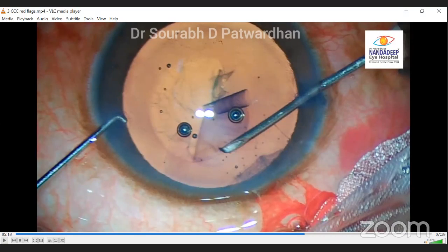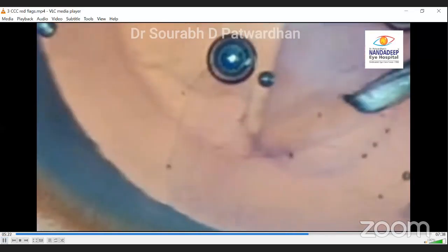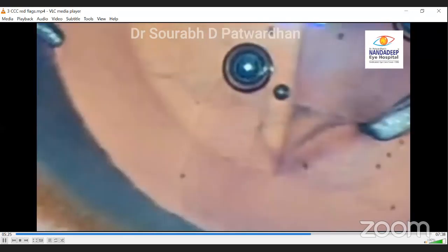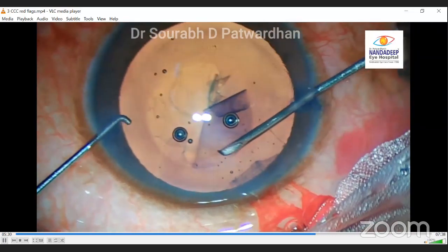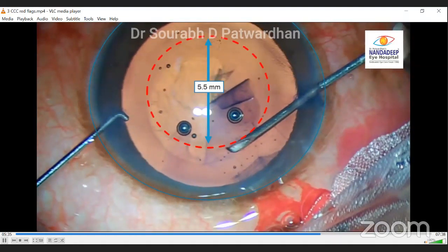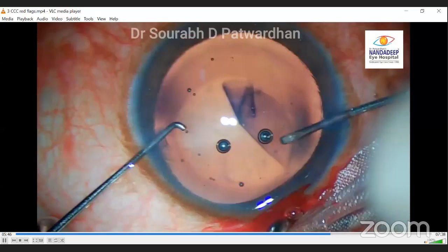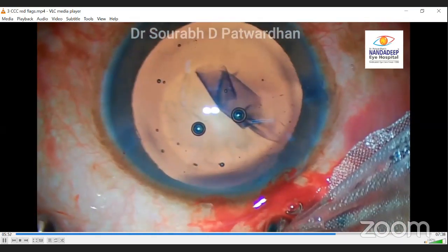Okay, let's proceed and see what exactly happened. So someone has given the answer. This is what the surgeon is seeing, very focused on the Capsulorhexis edge. Still, as you mentioned, he is not following the rule of center of triangle, too much in the periphery. Now look at the center. He is far away from the center. Because the pupil is well dilated, he underestimated the size of the rhexis, and the rhexis obviously went out into the zonules.